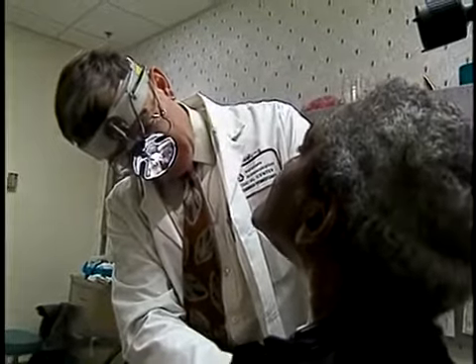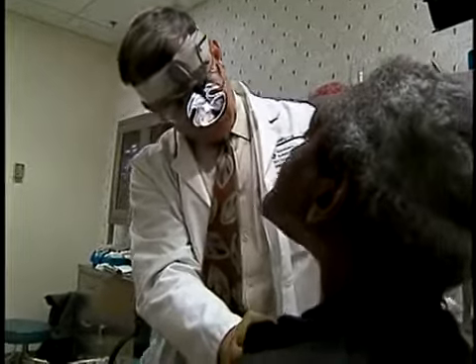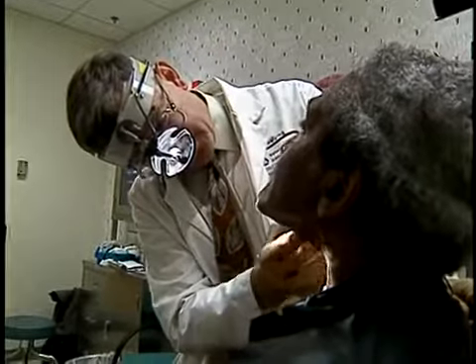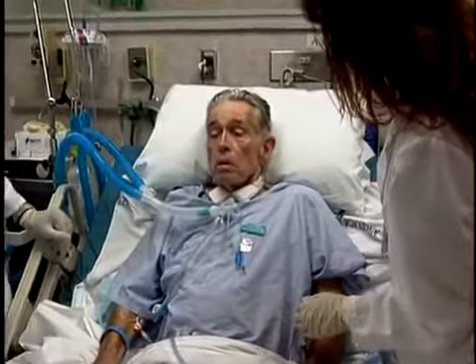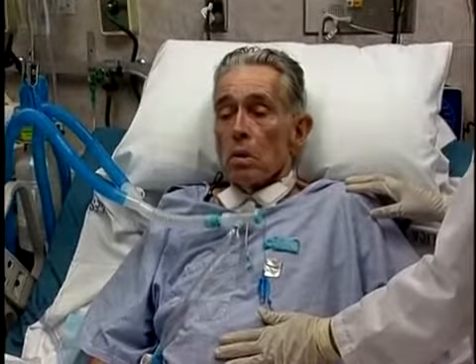Reevaluate for airway obstruction. If each issue has been identified and corrected and the patient continues to exhibit distress, consult the physician regarding the necessity of a bronchoscopy to detect airway lesions such as tracheal stenosis, vocal cord paralysis, or granulation tissue growth. Some patients have difficulty getting used to the change in breathing patterns. Ventilator-dependent patients are no longer used to exhaling through their upper airway and may forget how to exhale through their mouth and nose, requiring the clinician to work on various exhalation techniques and abdominal breathing exercises.